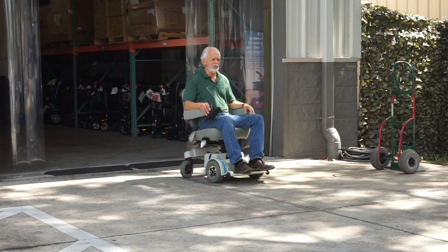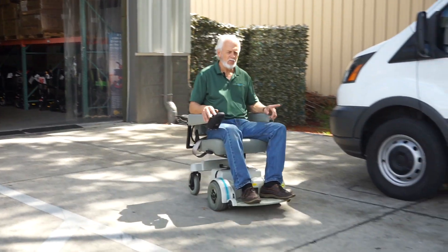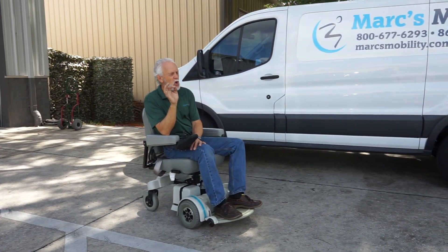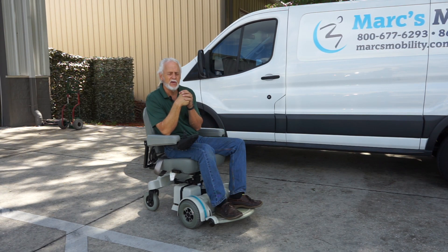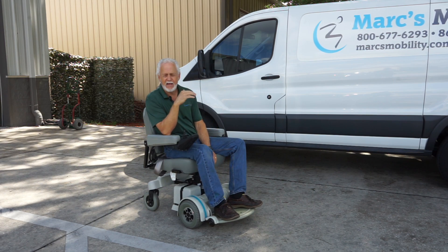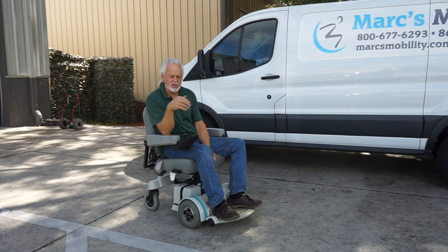This is a very easy chair to drive. You will hear the motors — they have a little bit of humming, which is normal. This chair has very heavy-duty motors, the kind they don't make anymore. They last forever. This chair also has the five-inch seat lift.